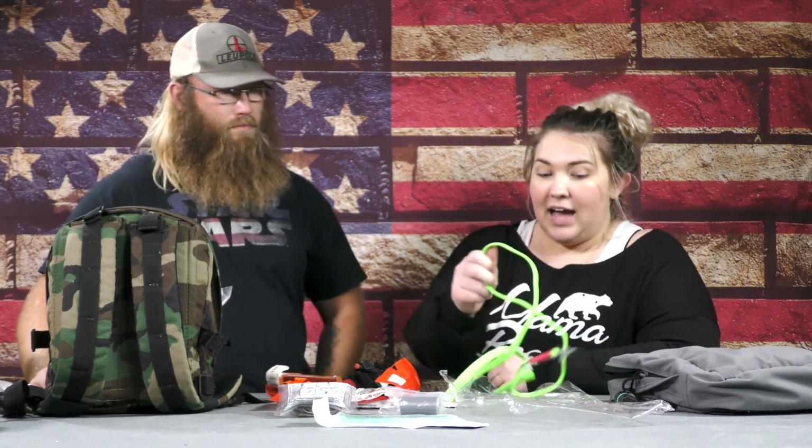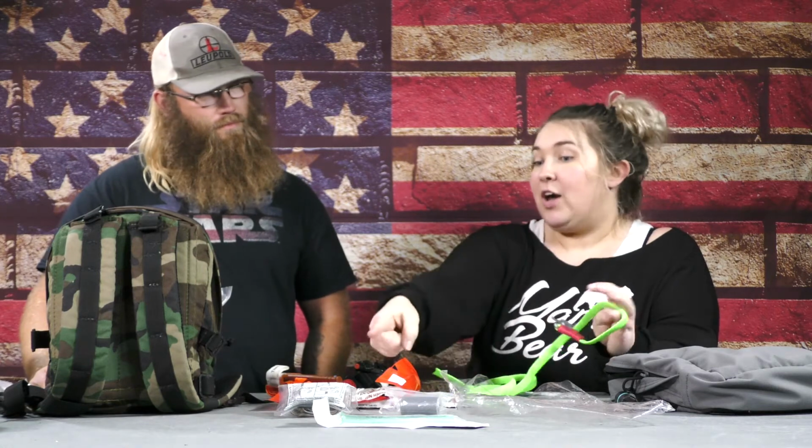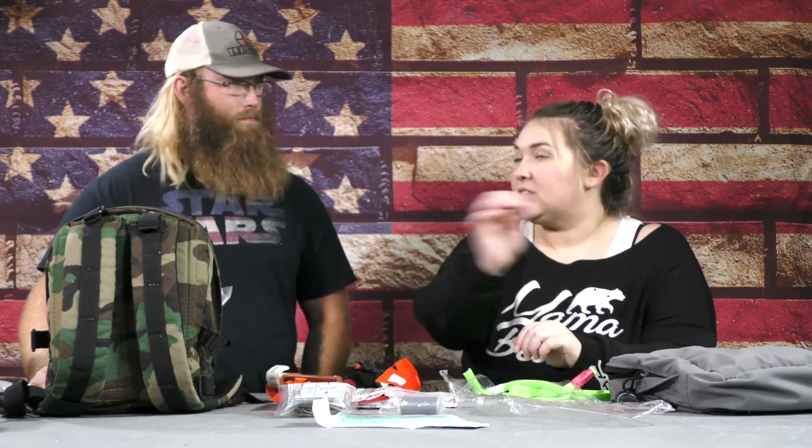We see failures with these on people who've actually trained with them in the shoot house more than any other one that I have. Like, I only have these in my Peds Med bag, and that's the bag that I carry in the car. Because I can walk them through, like, hey, put your hand through and then pull. I keep a lot of those tucked in different places in the car because I don't know where I'm going to be. I bought all the ones you had left. Those are really easy.